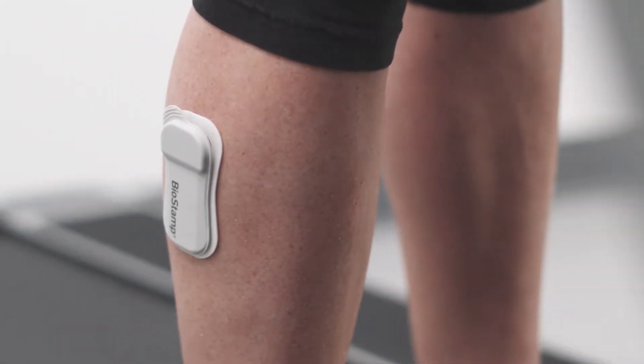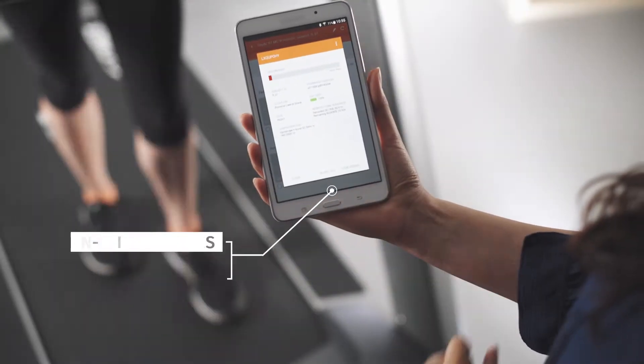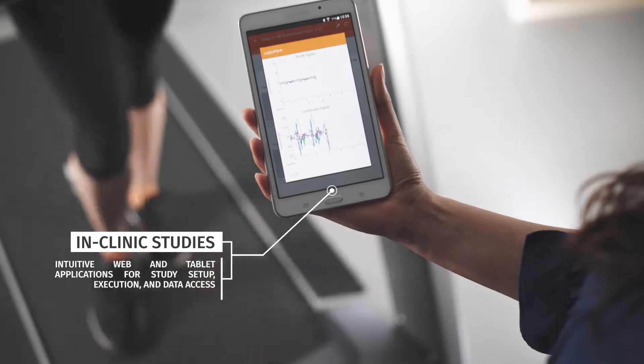Introducing Biostamp Endpoint, an FDA 510K cleared wireless remote monitoring platform intended for use by healthcare professionals and researchers to collect physiological data in clinical and home settings.